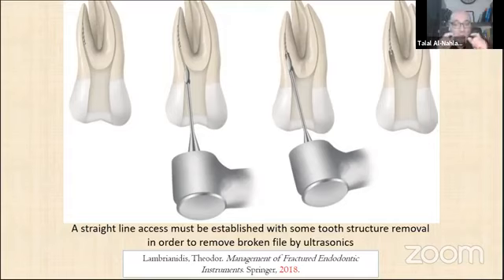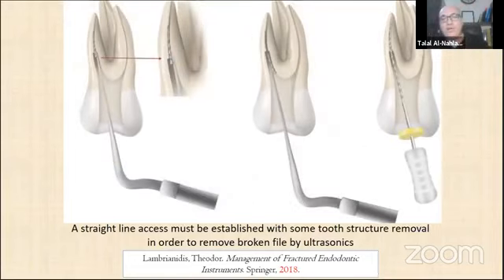But the problem, what, my friends? The problem is we try to remove a broken file, but we are not trained well on the patient with indirect vision, so we enlarge too much in order to see. But if you train on extracted teeth, 10 teeth, not more than this, you will have the experience to go and remove a broken file with your patient.